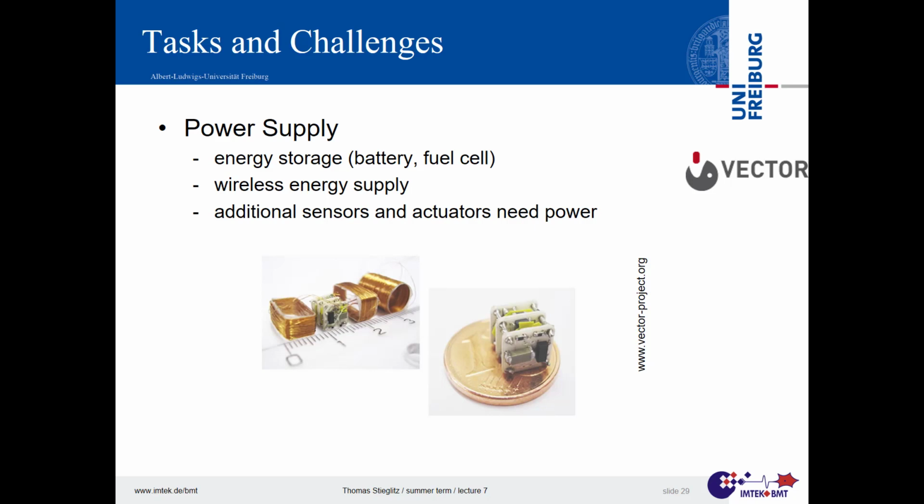In some cases, of course, there are other soft robotics that work differently, and this is also the vision: can we use that for making something useful inside the body? So let's say the necessary next generation of those approaches. But still far from being applicable, still in very fundamental research, but nevertheless something comes out, and probably the application is completely different to what has been expected. Here it was about stomach cancer.